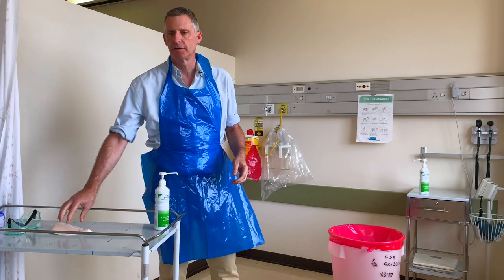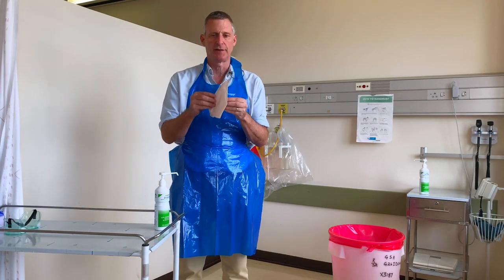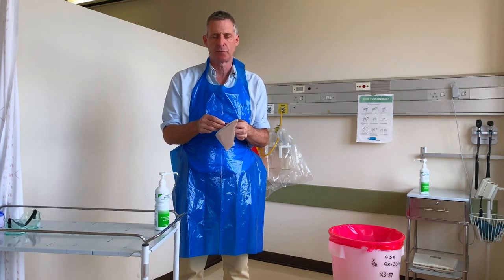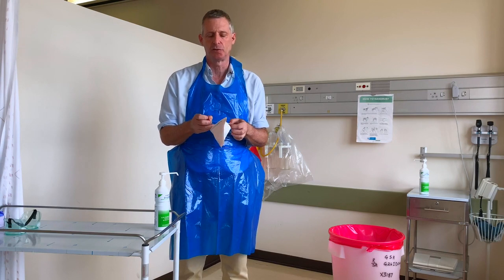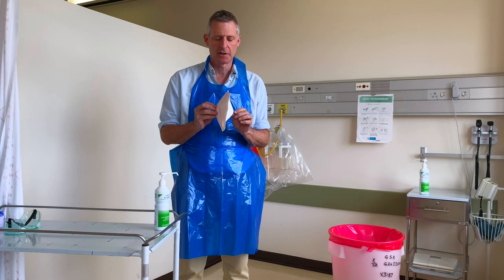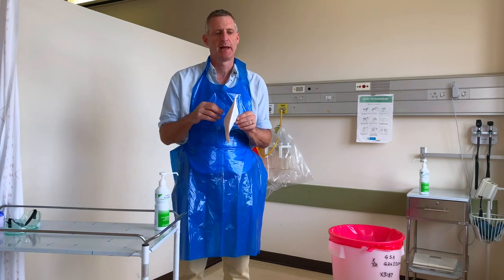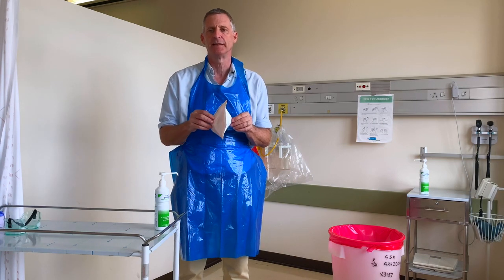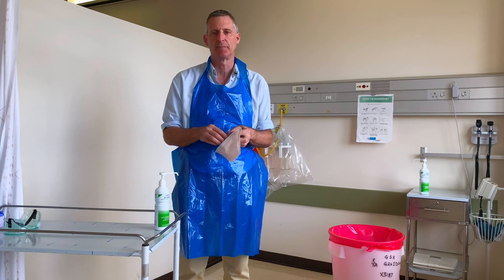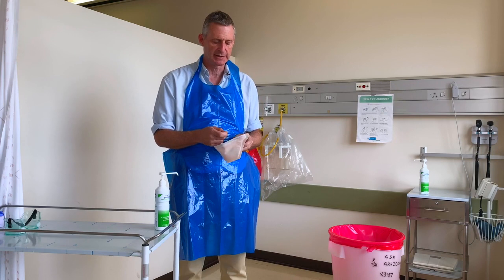The next piece of equipment I'm going to put on is an N95 respirator. If you're not performing aerosol-generating procedures — that is, for normal care — you would use just a surgical mask. The N95 respirator is used for procedures where an aerosol may be generated, such as taking nasopharyngeal and oropharyngeal swabs or intubating the patient.